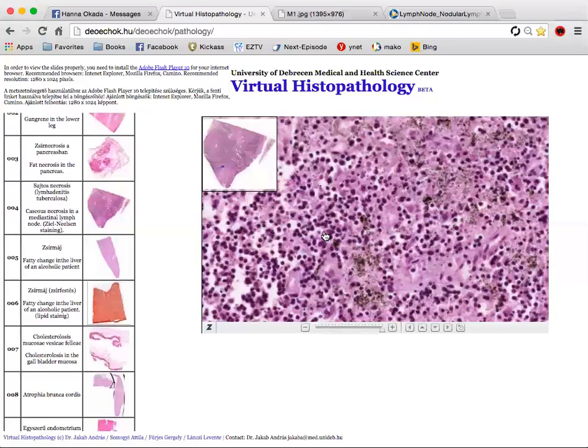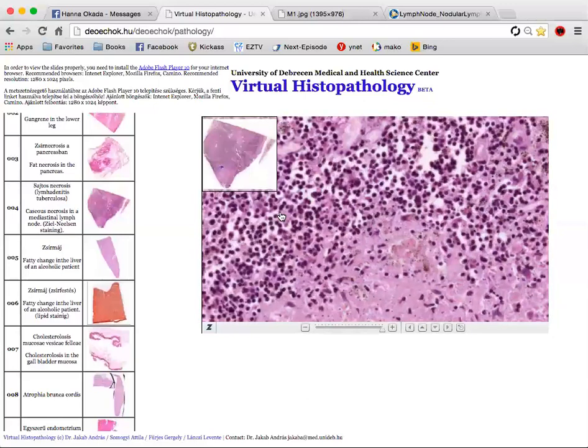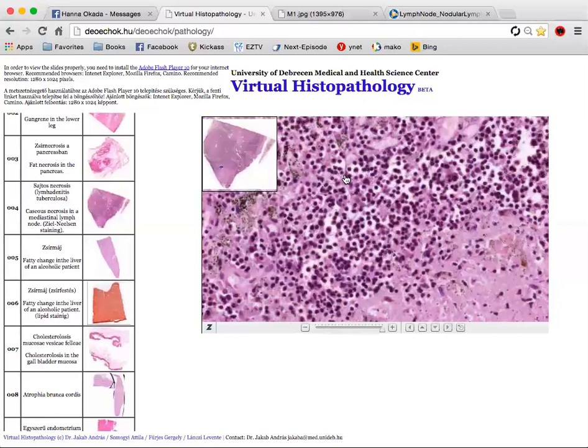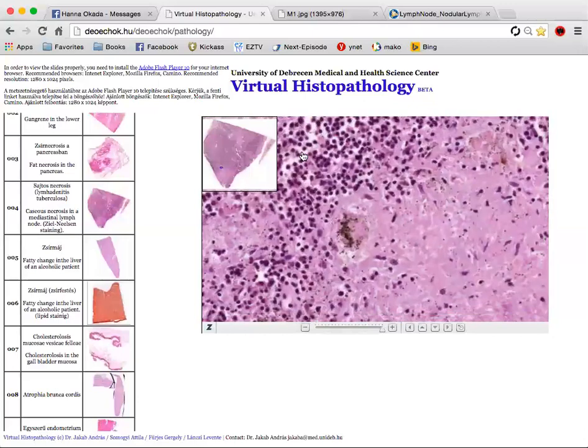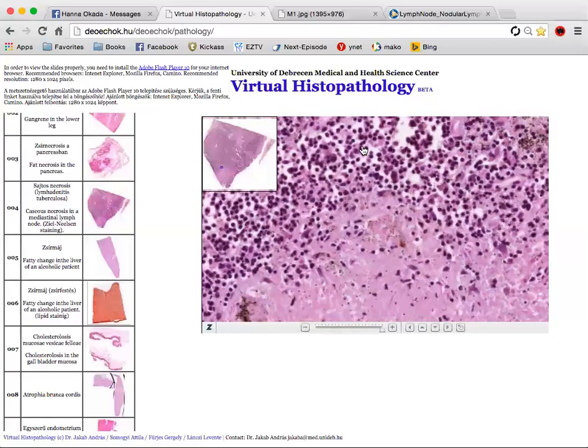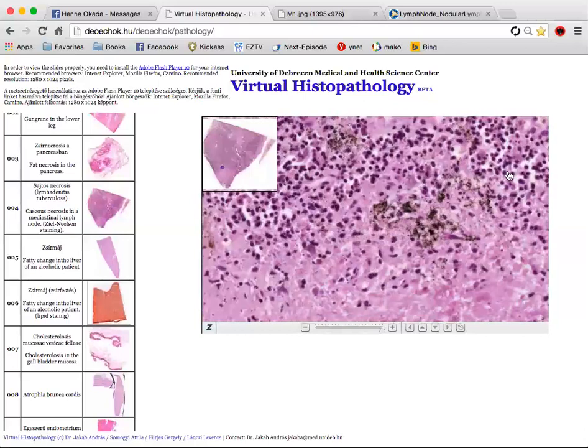But how about type 4 hypersensitivity? You say it can be referred to as chronic inflammation. Yeah, later on there would be a chronic immune infiltrate, especially here because there's a necrosis. So it started out with a hypersensitivity reaction. And this is a lymph node. You have to remember that this is a lymph node, so there would normally be a lot of immune cells in it. But here, they're keeping the necrosis from spreading. That's what they're doing there. It's still a type 4 hypersensitivity.